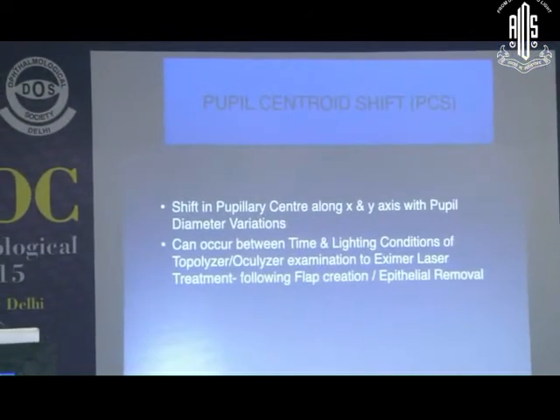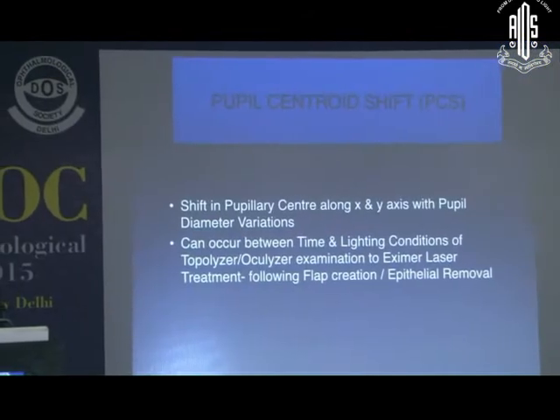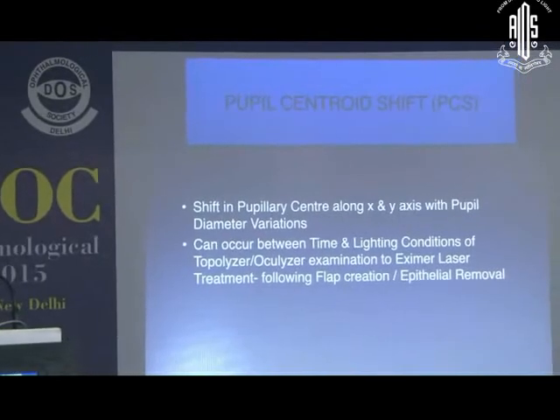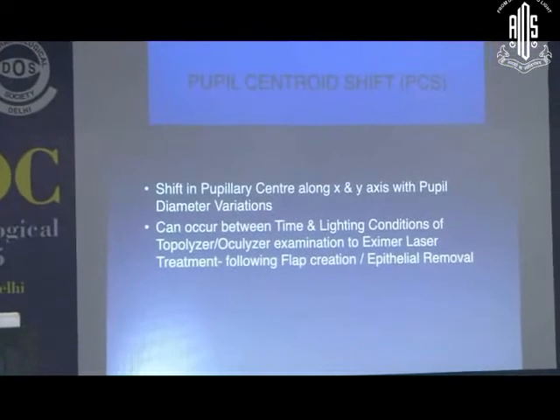So in conclusion, intraoperative online non-contact pachymetry is a useful tool in perfect real-time planning of ablation depth, optical zone, leaving of safe residual stromal bed, and thus increasing the safety and the predictability of LASIK surgery and customizing each and every case. The second part of my talk today would be on pupil centroid shift compensation, which is achieved with the newer WaveLight machines.